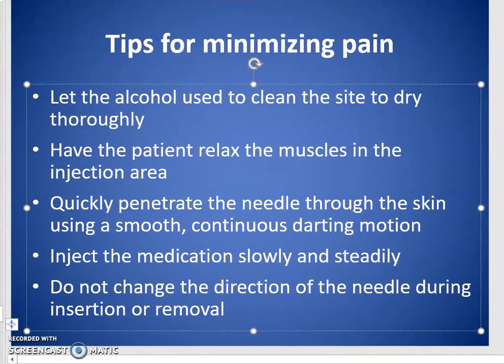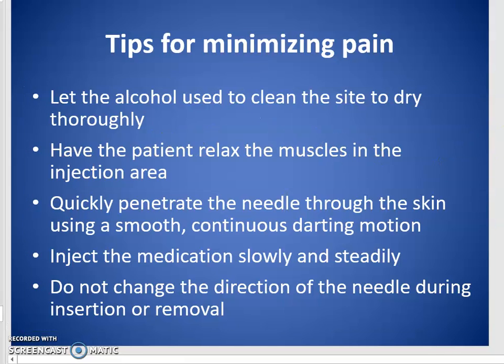There we go. Tips for minimizing pain. Let the alcohol used to clean the site dry thoroughly before you inject. Have the patient relax the muscles in that injection area, so have them shake their arm out. Starting a very casual conversation at this point is also good. For elderly folks, talking about their grandkids or vacations or their own children, anything to distract them for a moment while you're doing your work can be helpful.